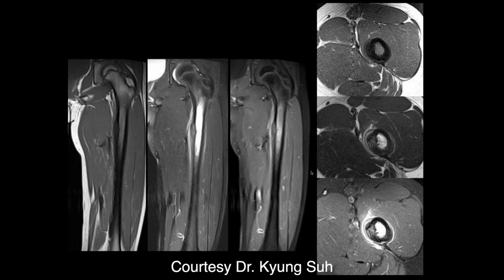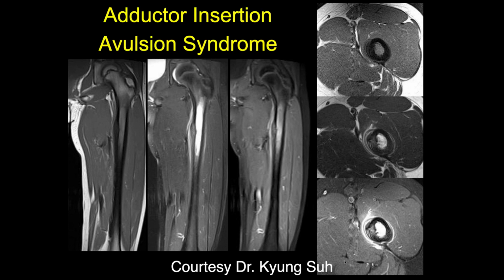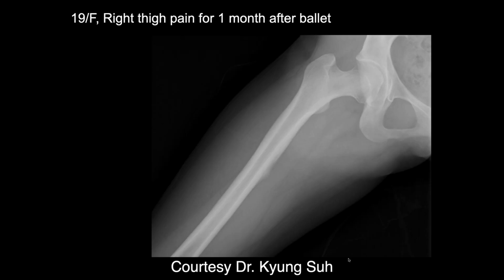Yeah, now on MRI we see, and that's an incomplete stress fracture. Yeah, this is one of the most obvious ones I've seen. I think John will agree with me. Yeah, this is a pretty significant injury. I've never seen one this bad before. This is pretty unusual too, because the kid is not in traction and getting surgery. Another name for this is the adductor insertion avulsion syndrome. I think this is a stress reaction. Don't you, John? I certainly do.